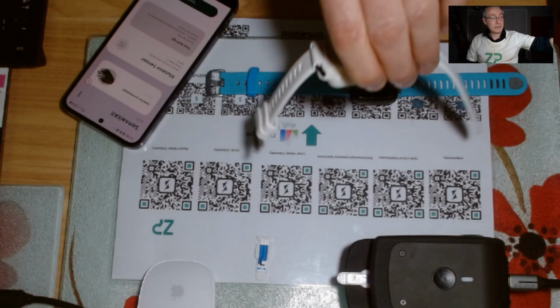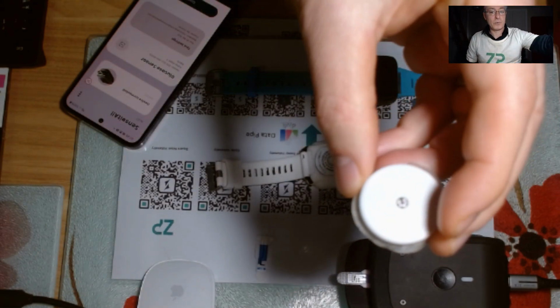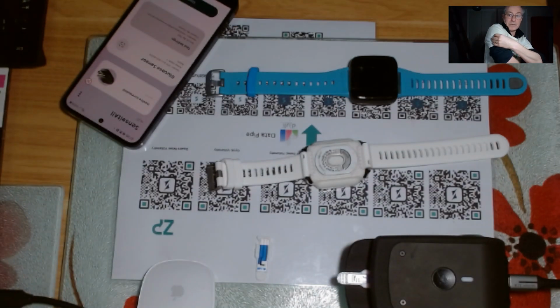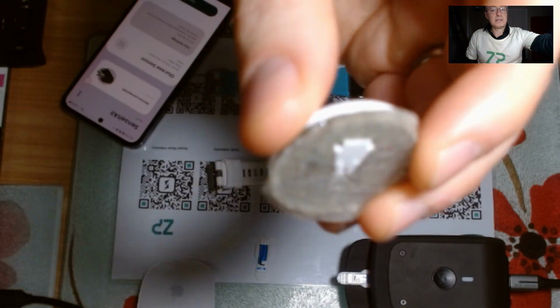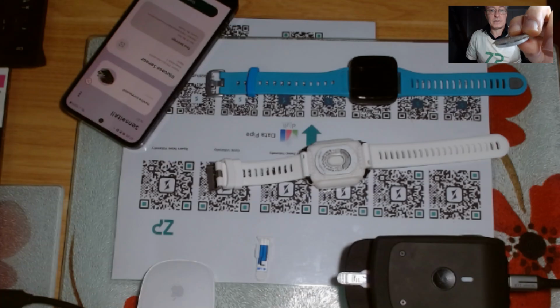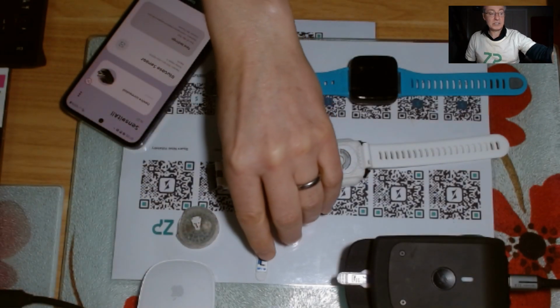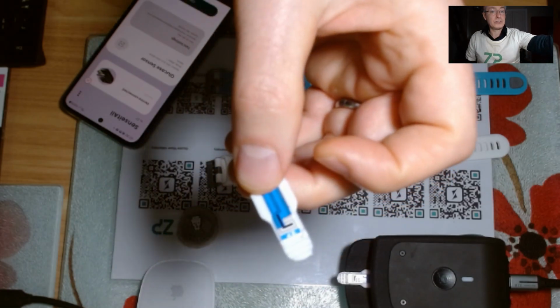In fact, there's a number of what we call CGMs, continuous glucose monitors, on the market. In fact, I have one behind me. And they're mostly using amperometry. So if you've seen people wearing these, they often wear them kind of here, next to the skin, not through the clothes. On here, there's a little filament. I'll maybe be able to get that filament to show, just against my finger there. That filament is actually the electrode system. So it's actually the same science as the little electrodes on here.